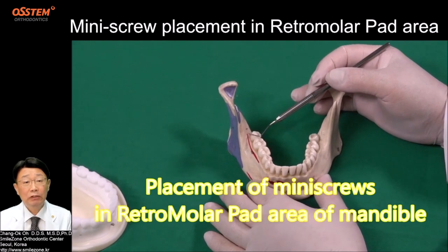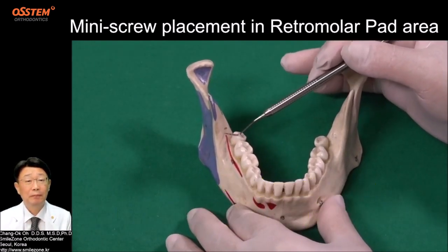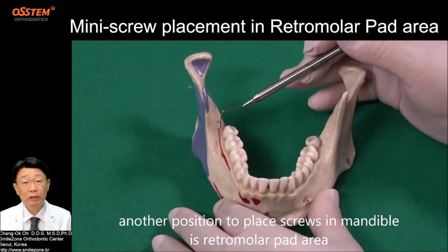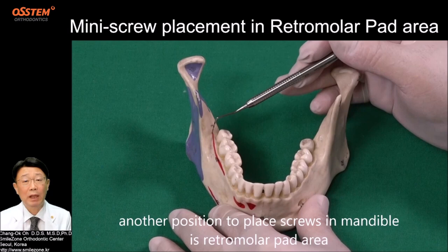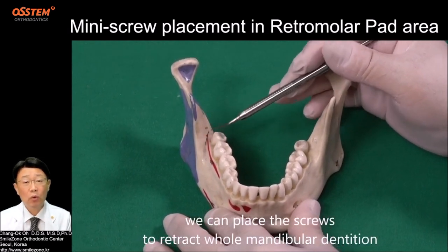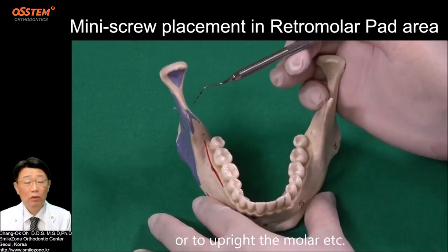Placement of mini screw in retro-molar pad area of mandible. Another position to place screws in mandible is retro-molar pad area. We can place the screws to retract whole mandibular dentition or to upright the molar, etc.